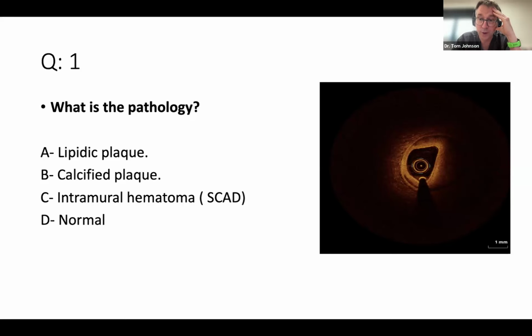It can depend on whether the artery is fenestrated or not, whether there's a defect in the lumen allowing blood to move from lumen into vessel wall. But it's really that medial band close to the luminal contour that makes it most likely to be intramural hematoma. But I think this is a really harsh question to open with.